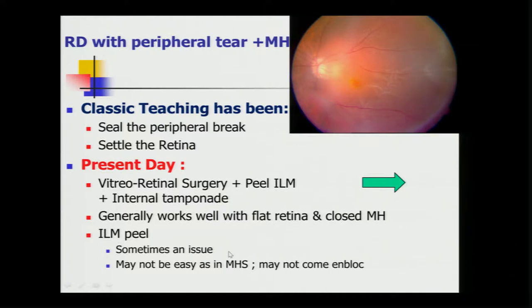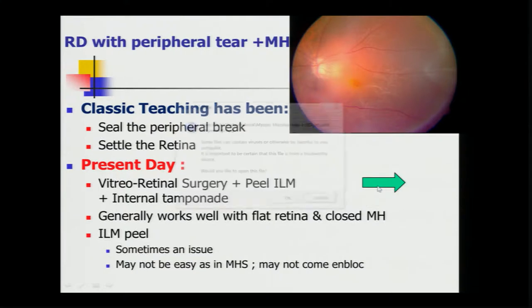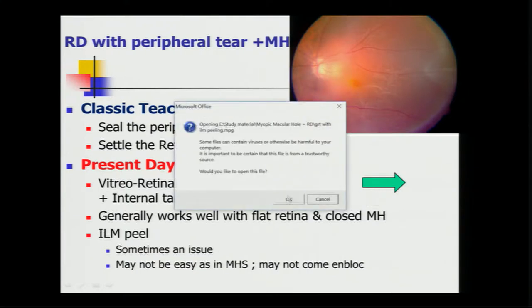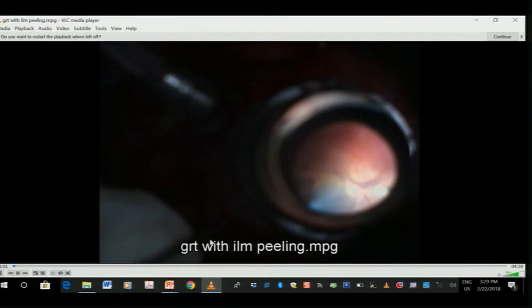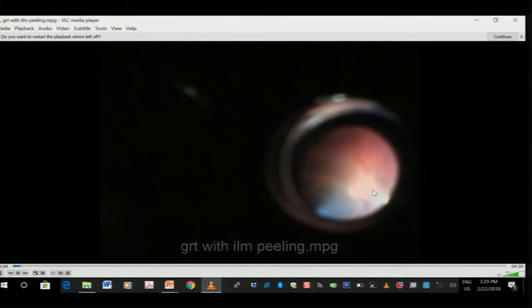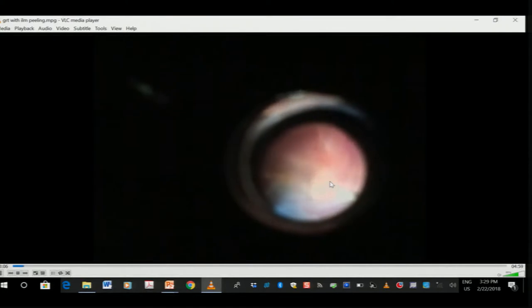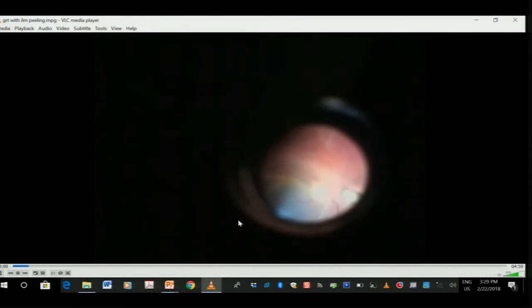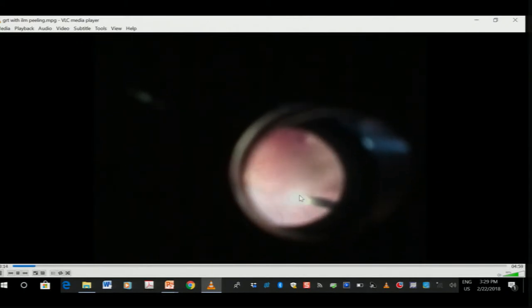But ILM peel is an issue here. It sometimes may not easily come out as in a routine macular hole surgery. This is one of my older videos, which this patient had a traumatic giant tear. Vitreous was hazy, so did not do any OCT prior to it. In fact, after this case, I have started doing OCT virtually in all patients. The key issue always is to separate the vitreous, which Atul has said you may require surgical adjuncts. Because it's a tight vitreous, especially in young patients and traumatic patients, which is very tightly adherent.